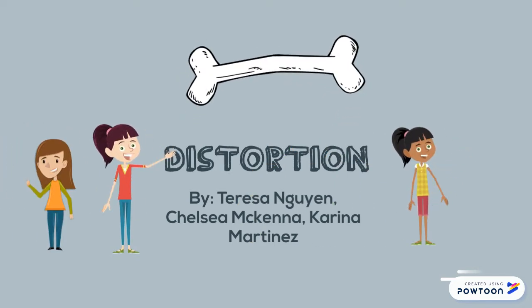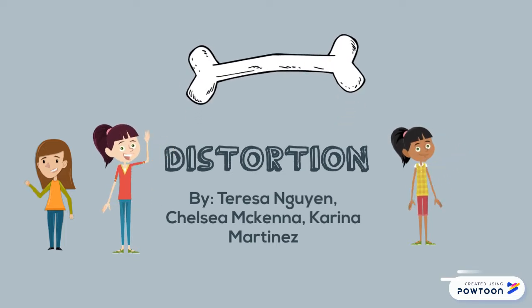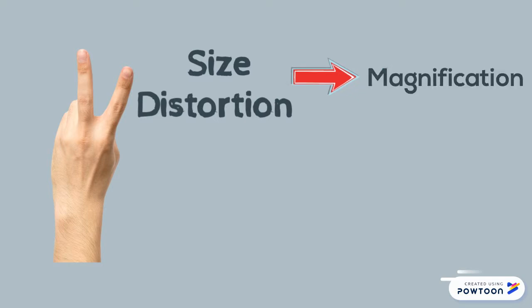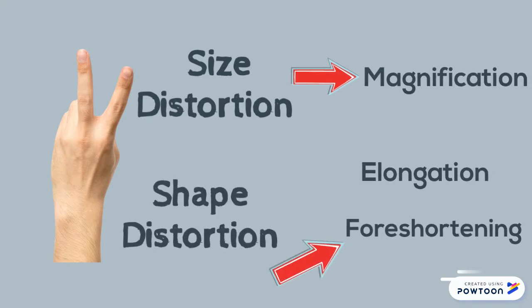Let's begin with the definition of distortion. Distortion is one of the geometric properties affecting radiographic image quality. It gives a misleading presentation of the size and/or shape of the imaged anatomical part. There are two types of distortion: size distortion that describes magnification, and shape distortion that describes elongation and foreshortening.